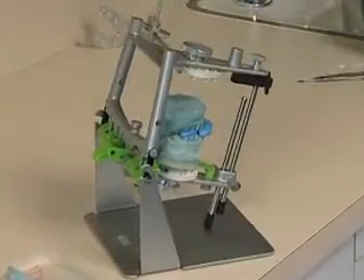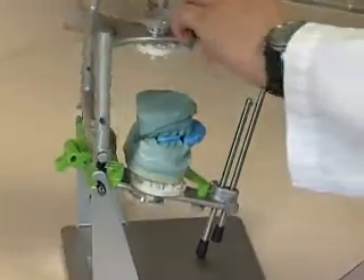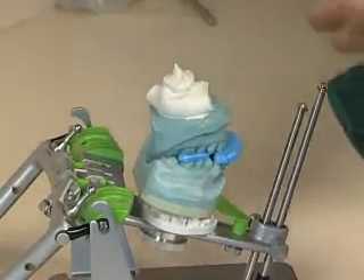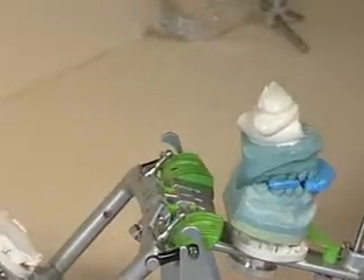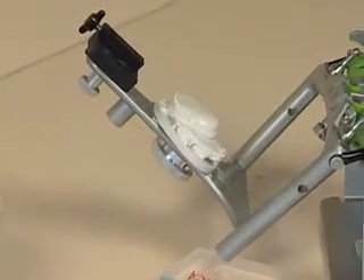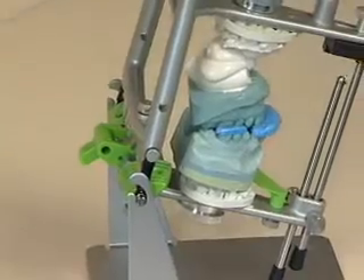We're going to need a lot of mounting stone, and we knew that when we saw the small amount needed on the upper. Go ahead and open it up all the way. We'll need two mixes to get this mounted correctly. Add some to your lower mounting plate. You're going to have to catch some of it — when you close it, it's going to come forward on you. Perfect — you did well.